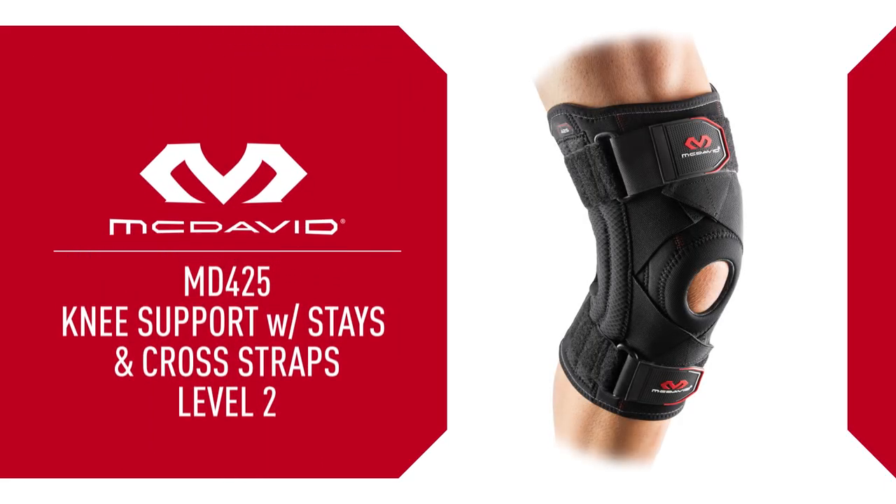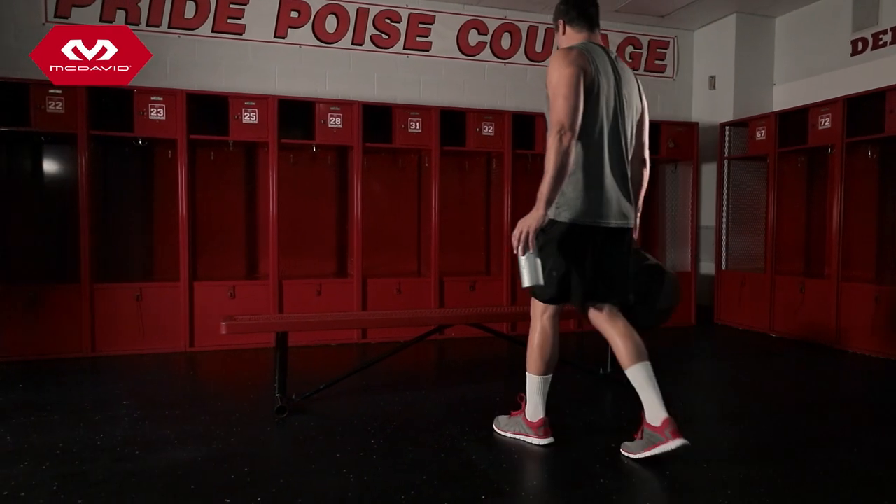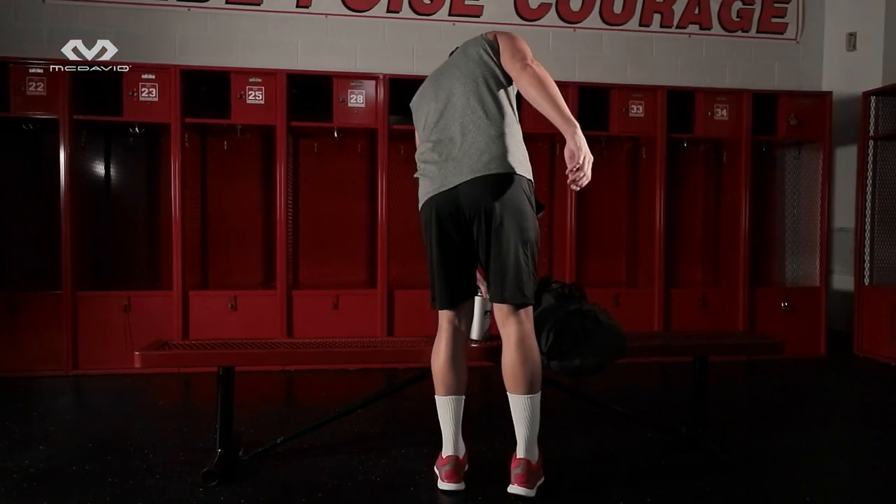The McDavid 425 Knee Support is designed to offer moderate protection and pain relief for various knee conditions. No matter how well engineered our products are, if the size is wrong, the support performance is wrong.